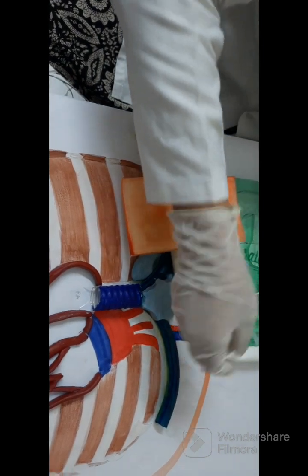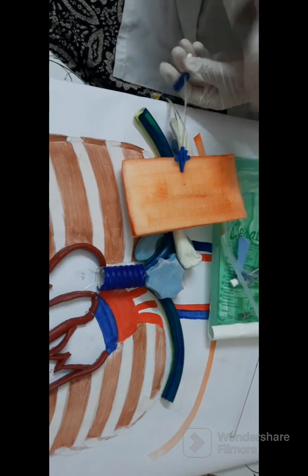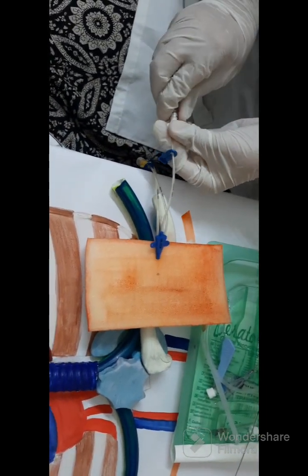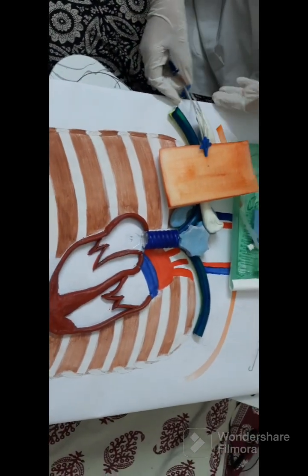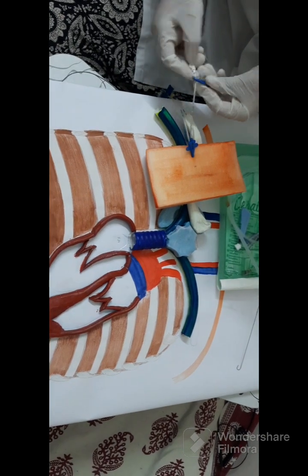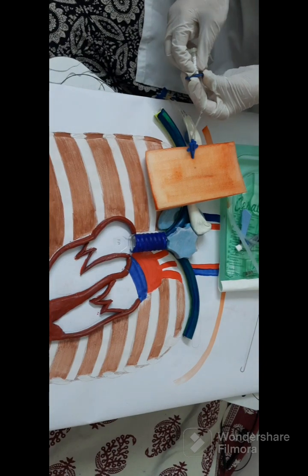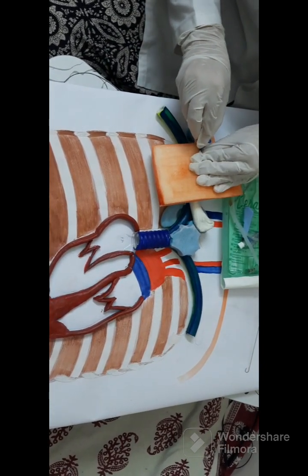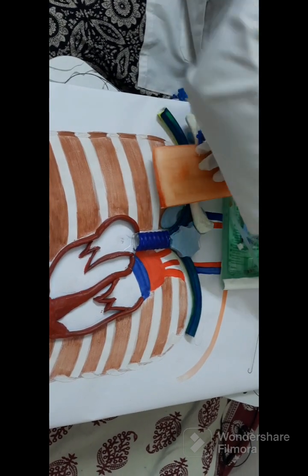And apply the lumen clamp. Usually we need to aspirate the blood present in this triple lumen, and then we will apply the lumen clamp, lumen lock. And then we will ensure that the catheter position is not moving and it is in its proper place.